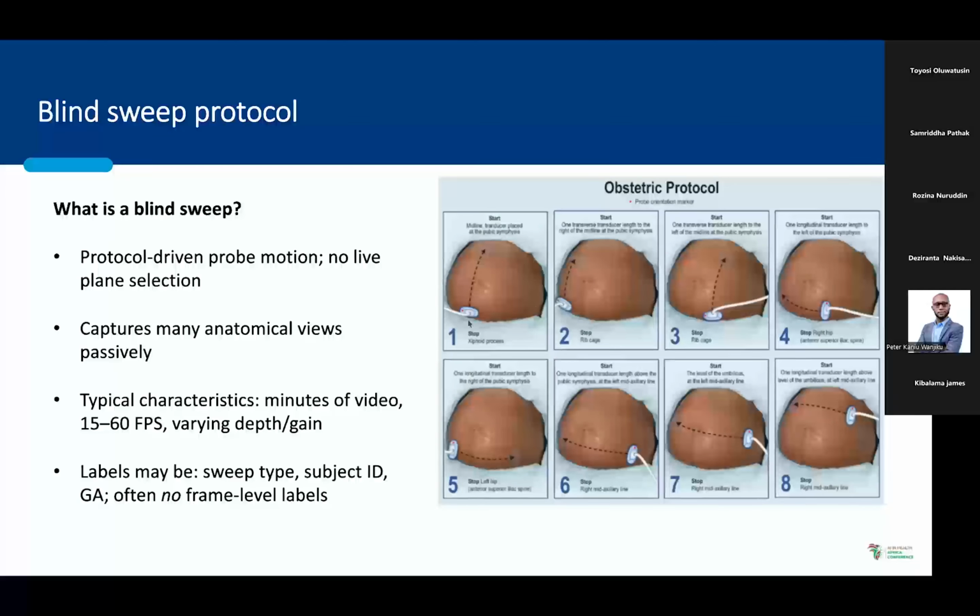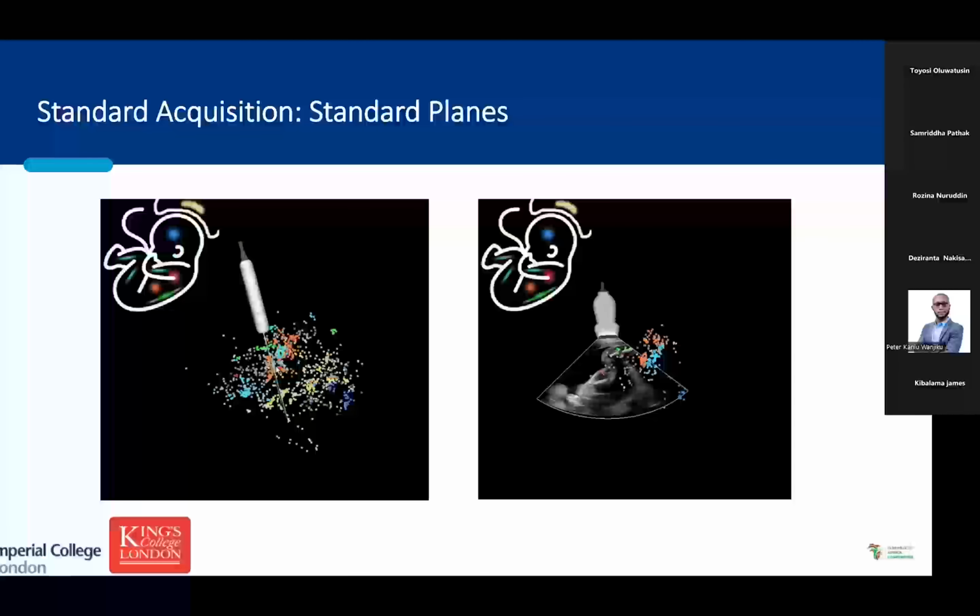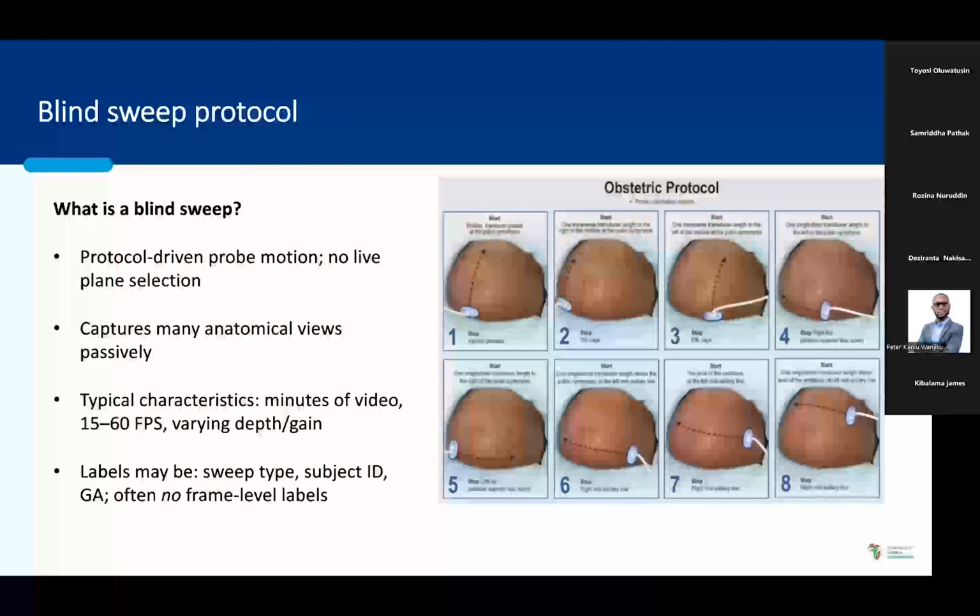This captures the anatomical views that I showed you earlier in this slide in a more passive way rather than actively looking for them. And it's more protocol driven. You don't move the probe and select the right plane, you just capture everything.